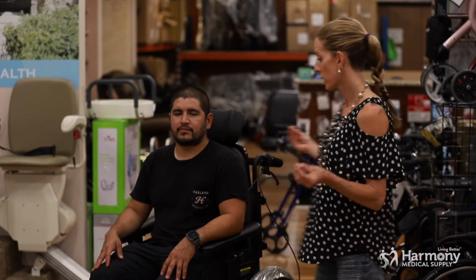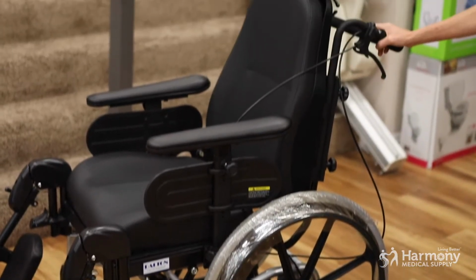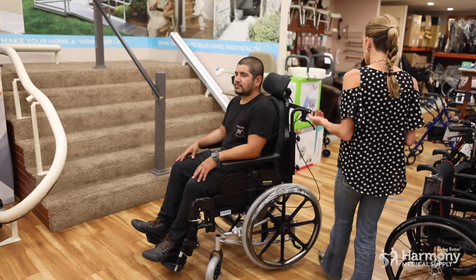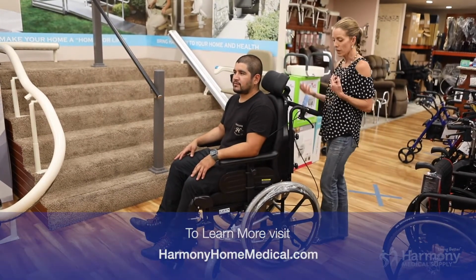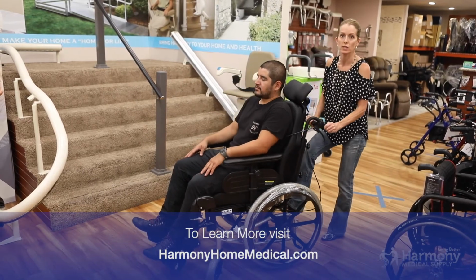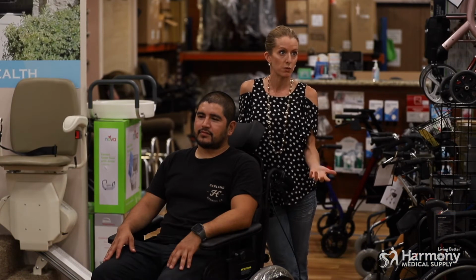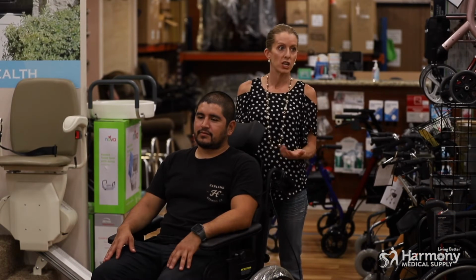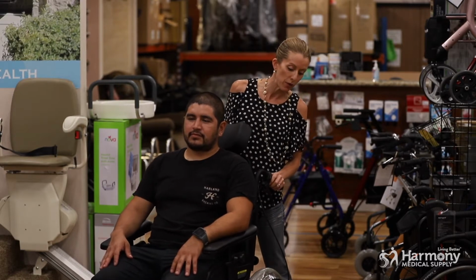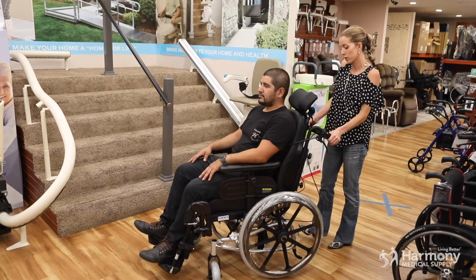A Tilt-In-Space Recliner is a wheelchair like we have here. It looks like a regular wheelchair, but it has the amazing features of tilt and recline. Now, I think we all know what recline is. Recline is when the backrest adjusts, and we see that in a lot of wheelchairs used for our senior population. It helps us change the back angle, change position, and reduces pain throughout the day. But what we don't see is them being used in a chair with tilt.